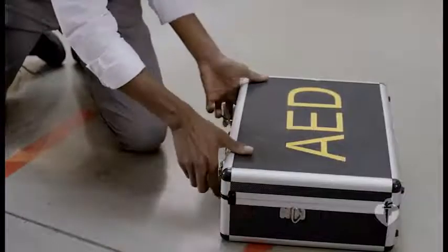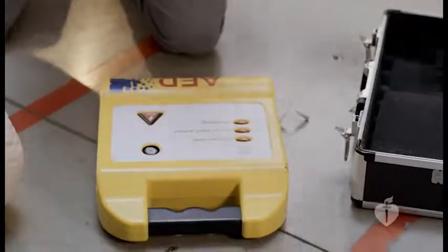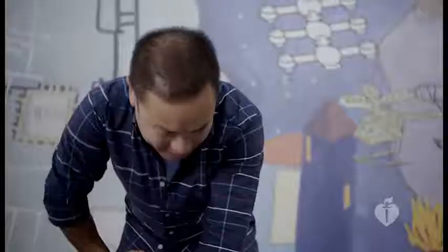1, 2, 3, 4, 5, 6, 7, 8, 9, 10, 11, 12, 13, 14, Attach 15, pads to 16, patient's 17, bare chest. 18, 19, 20, 21, 22, 23, 24, I got the AED. 25, Keep the 26, compressions going hard and fast while I hook it 29, up.